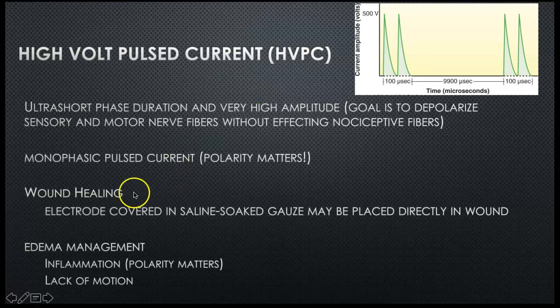So with wound healing, you can stick these electrodes right into the wound. We are not going to do that in our lab, but just know you could. But you can use it for edema, and we will practice using it for that reason. Later, when you get in your integumentary class, you might do this where you stick it directly in wounds.